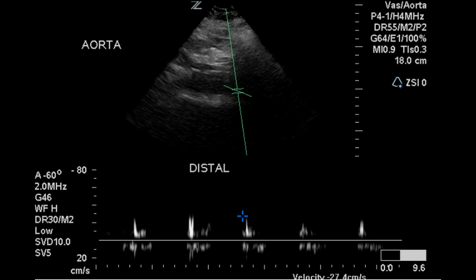This is an abbreviated ultrasound study due to the body habitus of the patient. There is a possibility of aortic dissection, as evidenced by an echogenic smooth flap. Alternatively, this flap could represent the surface of anterior thrombosis within the lumen of the aorta. Additional tests would be required to clarify this.